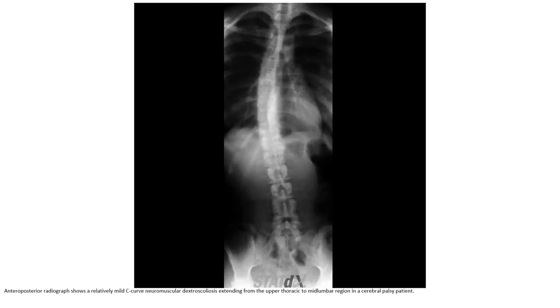AP radiograph showing a relatively mild C-curve neuromuscular dextroscoliosis extending from the upper thoracic to mid-lumbar region in a cerebral palsy patient.